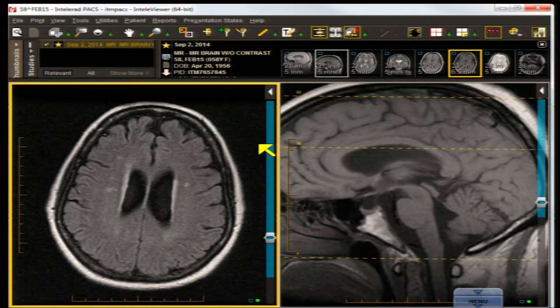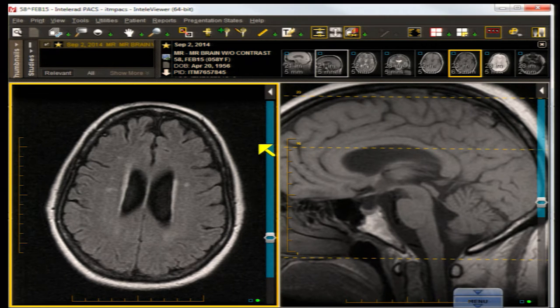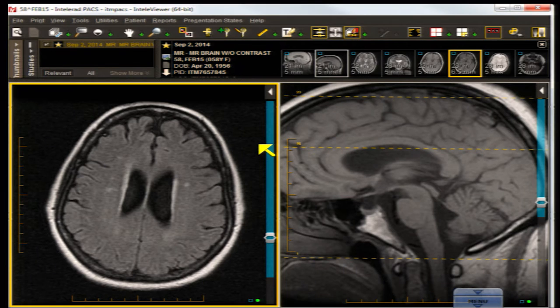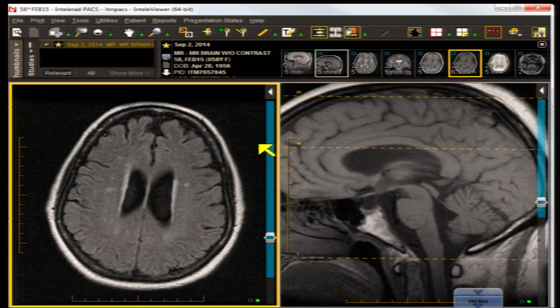Dementia with Lewy bodies has a very nonspecific pattern of atrophy, though bilateral putaminal involvement may suggest the diagnosis. Lewy body patients have visual hallucinations, not present here. Frontotemporal lobar dementia does have an anterior hippocampal pattern of atrophy — that is the correct answer — whereas Alzheimer's disease has a more temporoparietal pattern but also involves the hippocampus and entorhinal cortex. Mild cognitive impairment should have little to no atrophy. Parkinsonian dementia has a diffuse pattern with typical iron distribution changes in the brain stem.